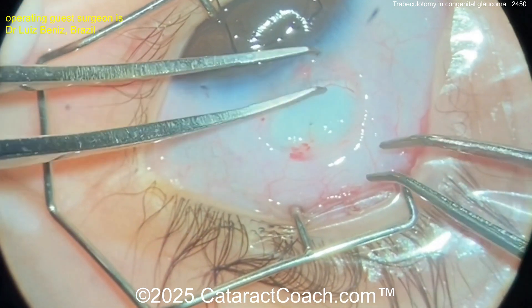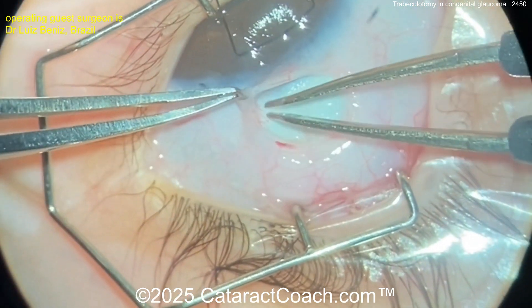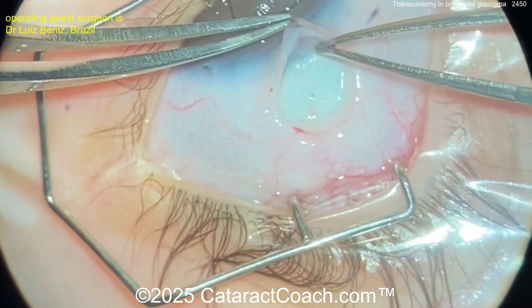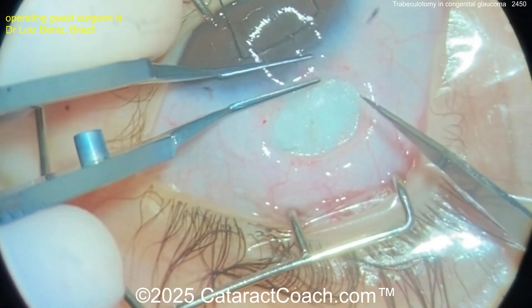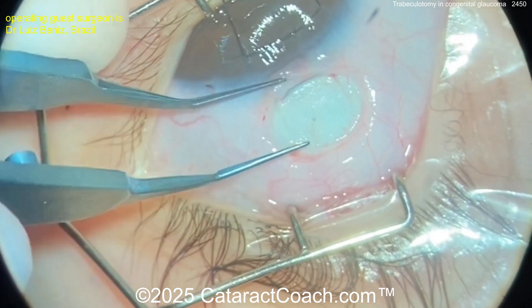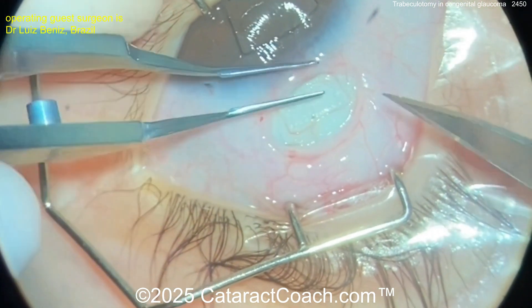That's probably from the epinephrine — look at that vasoconstriction by applying it there. Maybe a little bit of cautery as well. That looks great — just gentle on the cautery here. Now remember, we've got to access that trabecular meshwork and open it up; we're going to open up Schlemm's canal.